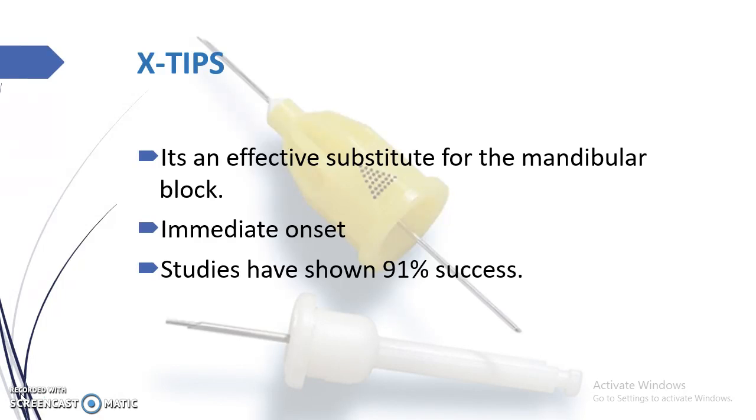X-tip is getting common these days as it's an effective substitute for mandibular block. It has an immediate onset, and studies have shown a 91% success rate.